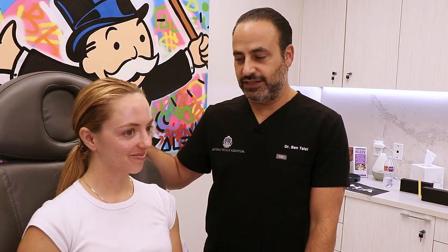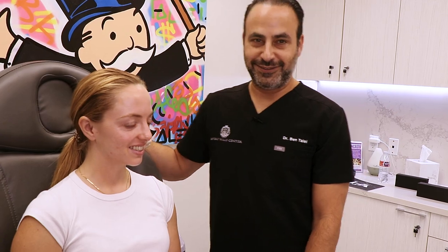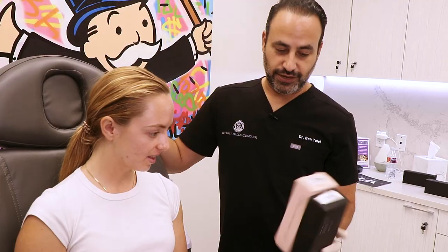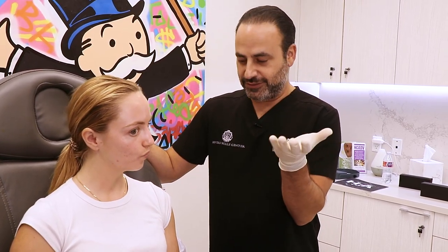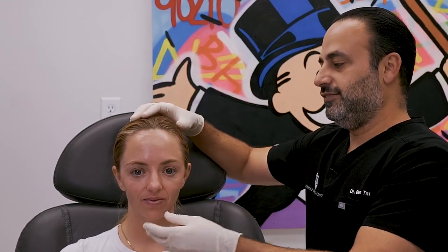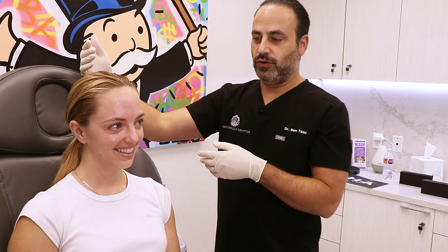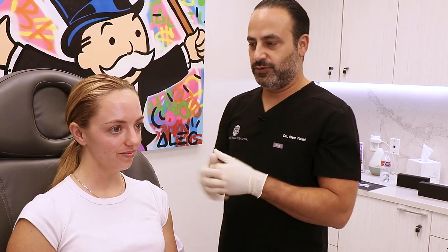Allison's our patient today. She's never had anything done. Today we're using our lovely Reveness products. We have several different types, but on this face we only really need one, maybe two. Just a quick analysis: Allison's face is lovely and looks young, so we don't need to do anything for youth. We're going to work more on accenting and making things balance more.